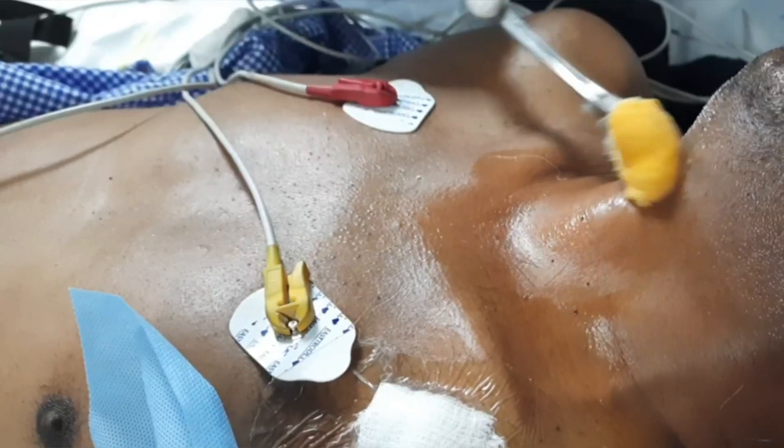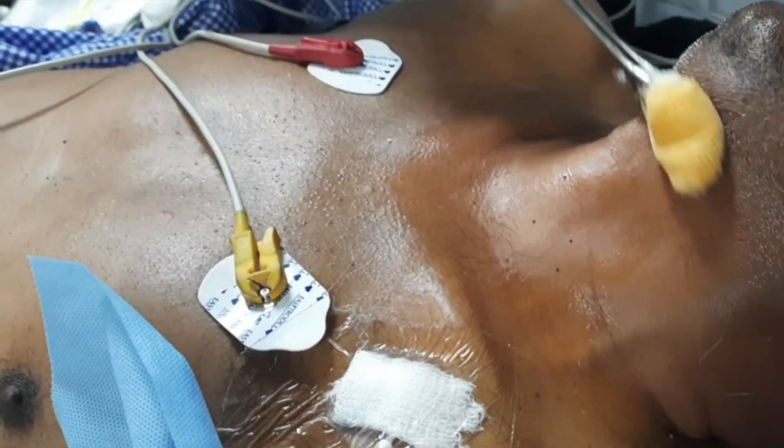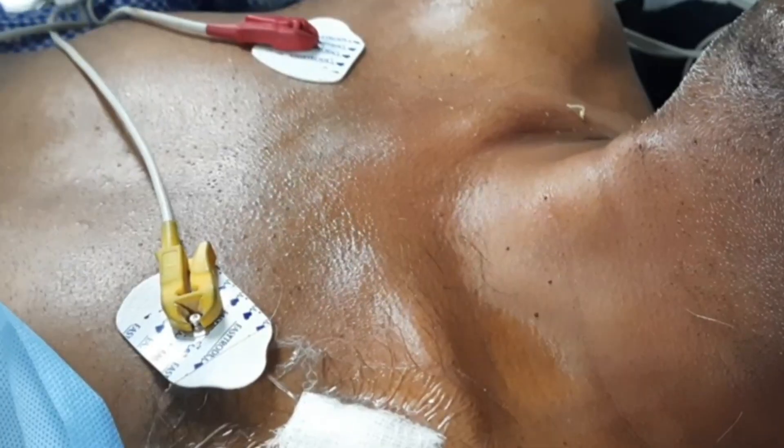Before starting the tracheostomy procedure, we have to adjust our existing endotracheal tube. You can adjust it under bronchoscopy guidance or just pull it blindly two to three centimeters. Just make sure that the cuff of the endotracheal tube is just below the vocal cords. This is our patient in whom we are going to do percutaneous tracheostomy.